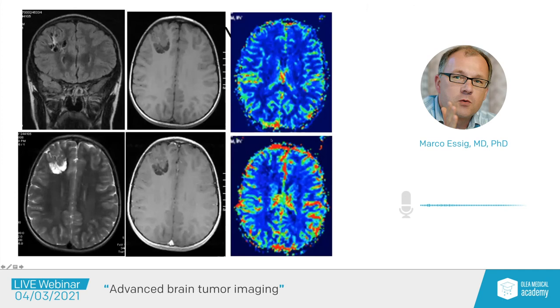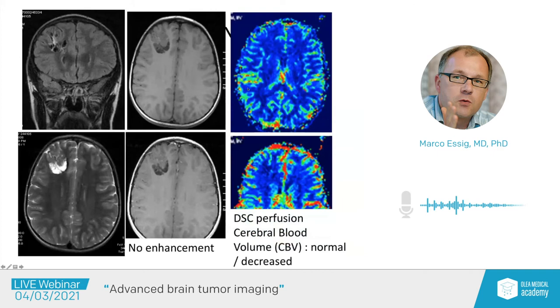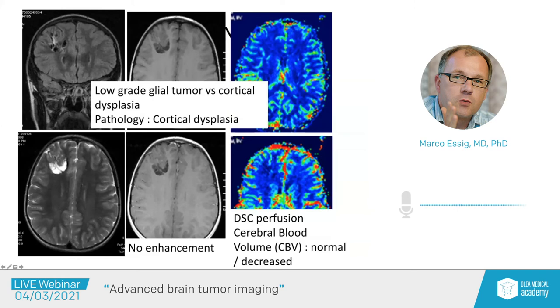Here we use perfusion imaging to differentiate between tumor and non-tumorous tissue. A patient had a brain lesion with seizures: the lesion was not enhancing and had no increased perfusion — blood volume and blood flow were normal. This is likely not a tumor; this is cortical dysplasia. This is important information because it is a lesion that can be watched, with no real treatment option unless resected to control seizures.